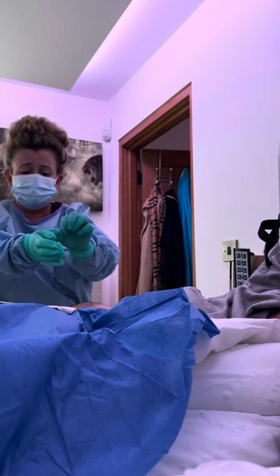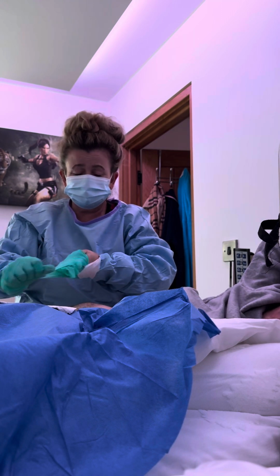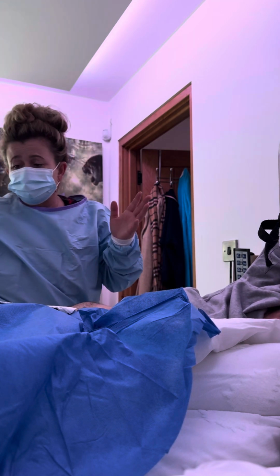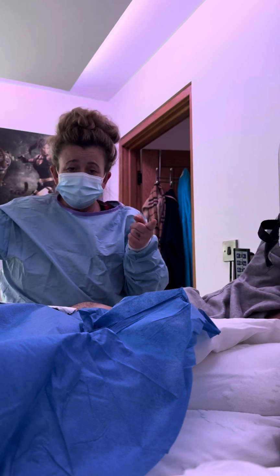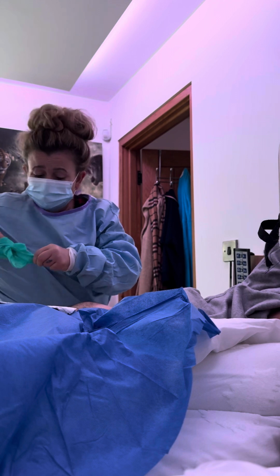So let me get this glove off. I reckon we just had a bad batch, personally. We have had a bad batch where the balloon's just not worked. So what I'm going to do now is take a reading.